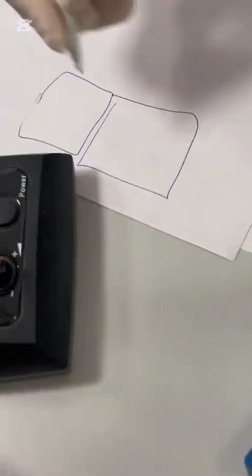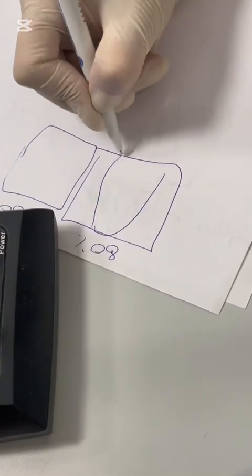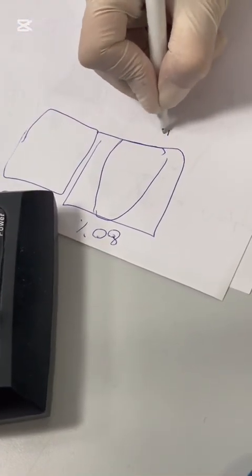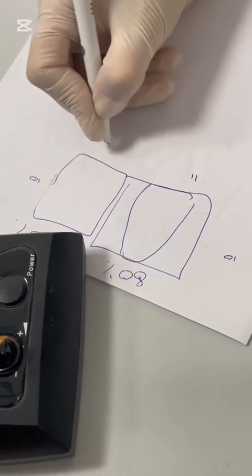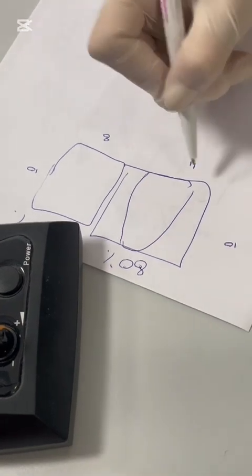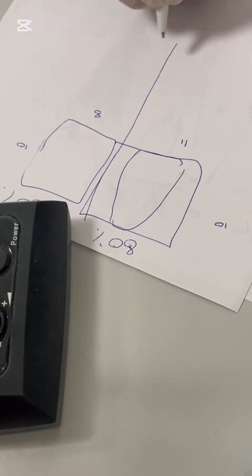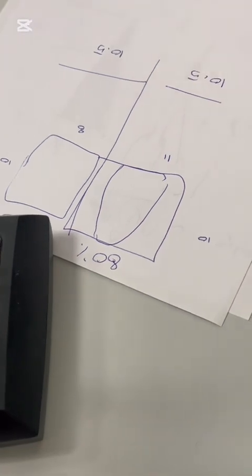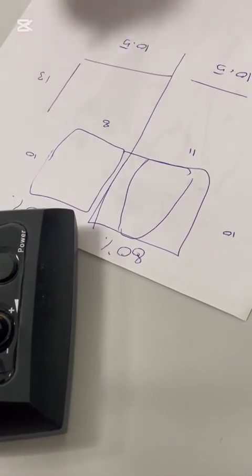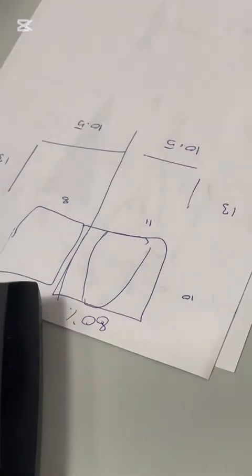Here is the first central incisor. Here is the second one. 80%. Here I have 11 to 10. Here I have 10 to 8. Now I wanted to split this space to be in its ideal situation. So this will be 10 and a half width, this will be 10 and a half width, and the length should be 13, 13. This is the goal.